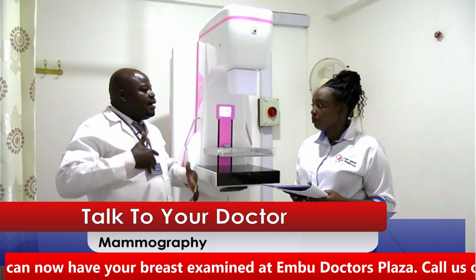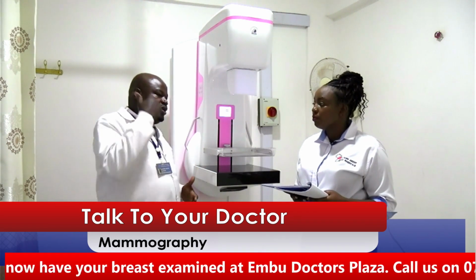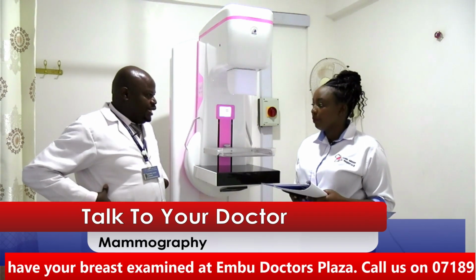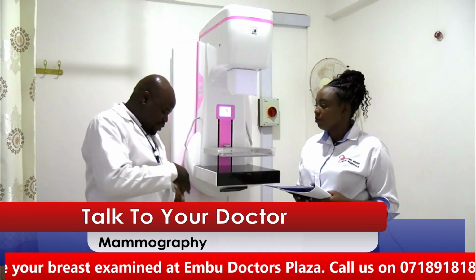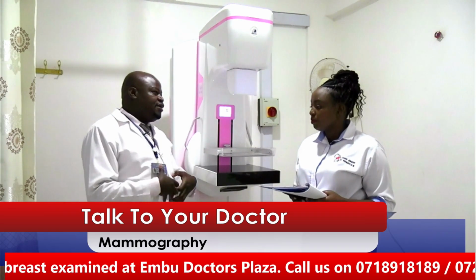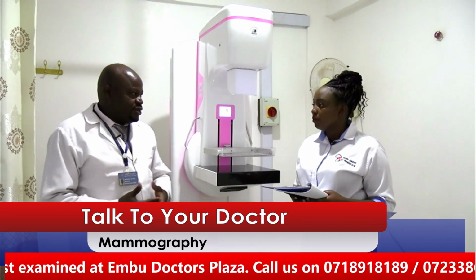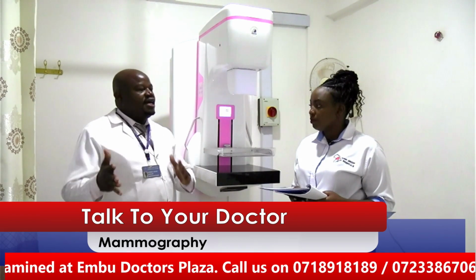Although there is a protection that we do. We have a protective measure. We have a lead gown that we cover the mother with. We make sure that we cover the baby completely. So you see the breasts are up, and there is a way we cover the belly with the lead gown to protect the baby from getting ionizing radiation. Although now, as I say, we discourage doing the mammogram so much. But now we have to weigh the advantages and disadvantages.